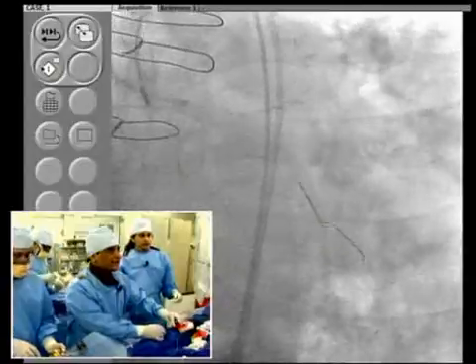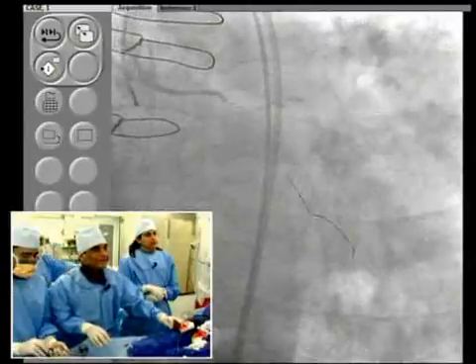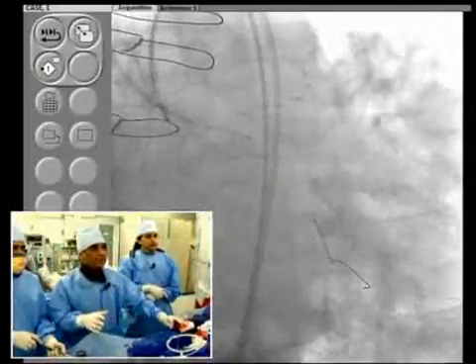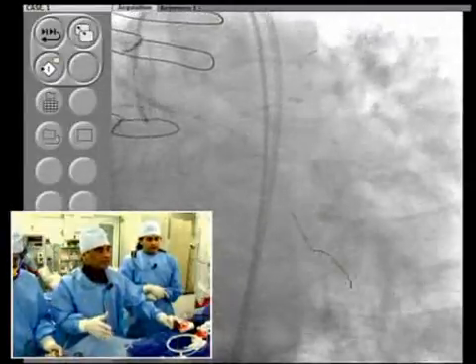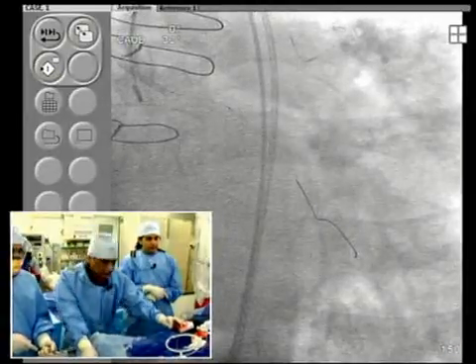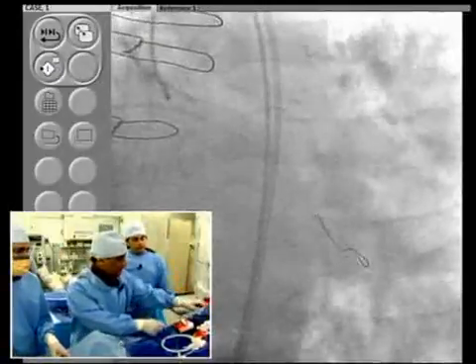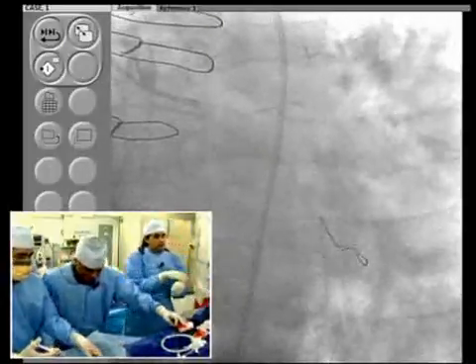I can tell you the classical case we had 4 years ago in our June symposium. Dr. Suzuki did the right coronary artery and could not open it. Dissected, did IVUS, everything, nothing. So 2 or 3 months later we brought the patient back. It was unsuccessful on June 13th at the symposium. 3 months later, that RCA had completely healed. There was just a focal lesion in the distal RCA which required one single stent. It was unsuccessful on day 0, but at follow-up we didn't have to do anything, just put one stent. I moderated that case and remember it well. Yeah, and you don't forget easily working with Dr. Suzuki.